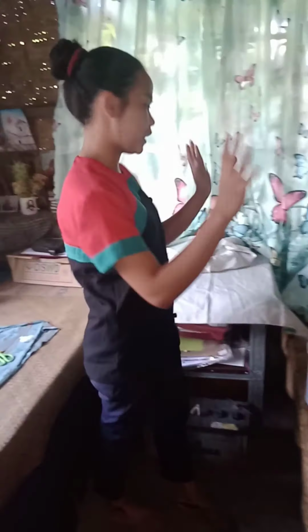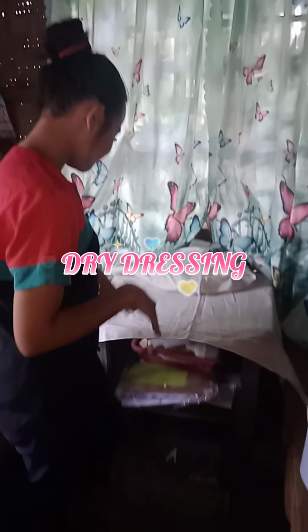Then after that, it is the time to open the sterile dressing tray, or you can also have your individually wrapped sterile supplies, and place it on the bedside table, as you can see. Then it is the time to apply the dressing. But there are two types of dressing: the dry dressing and the wet to dry dressing. So let's go first to the dry dressing.